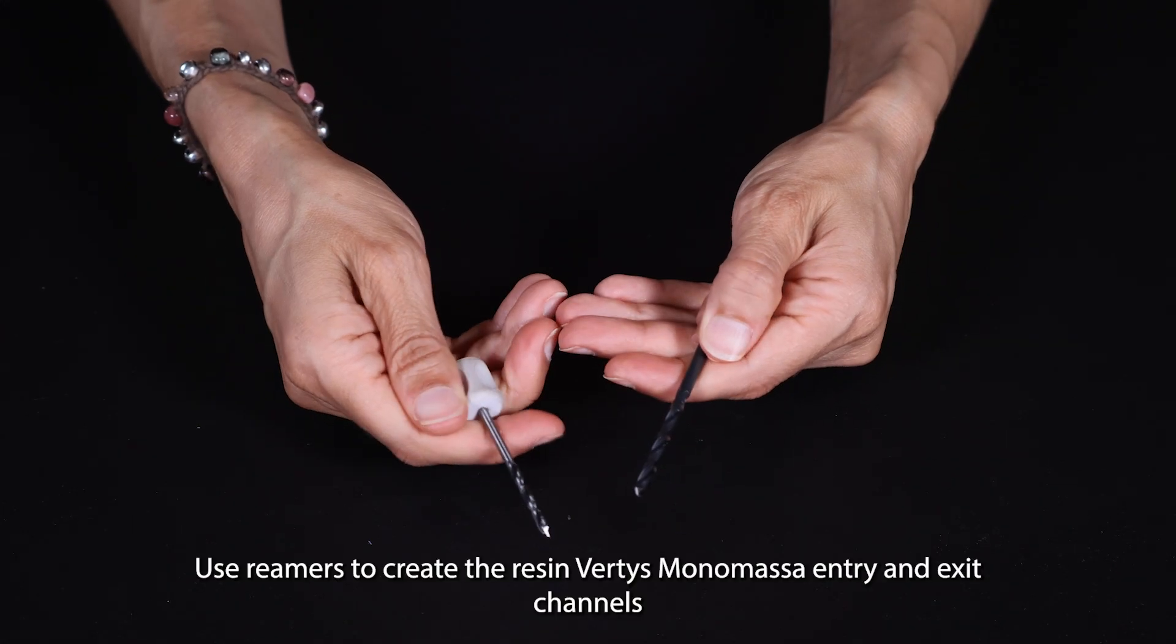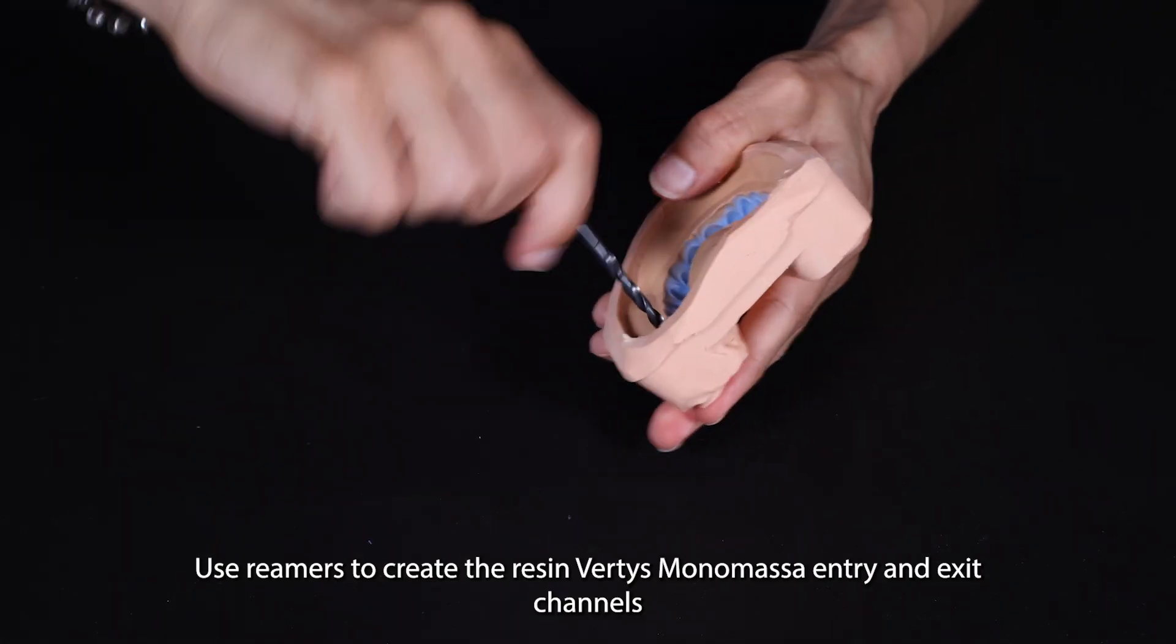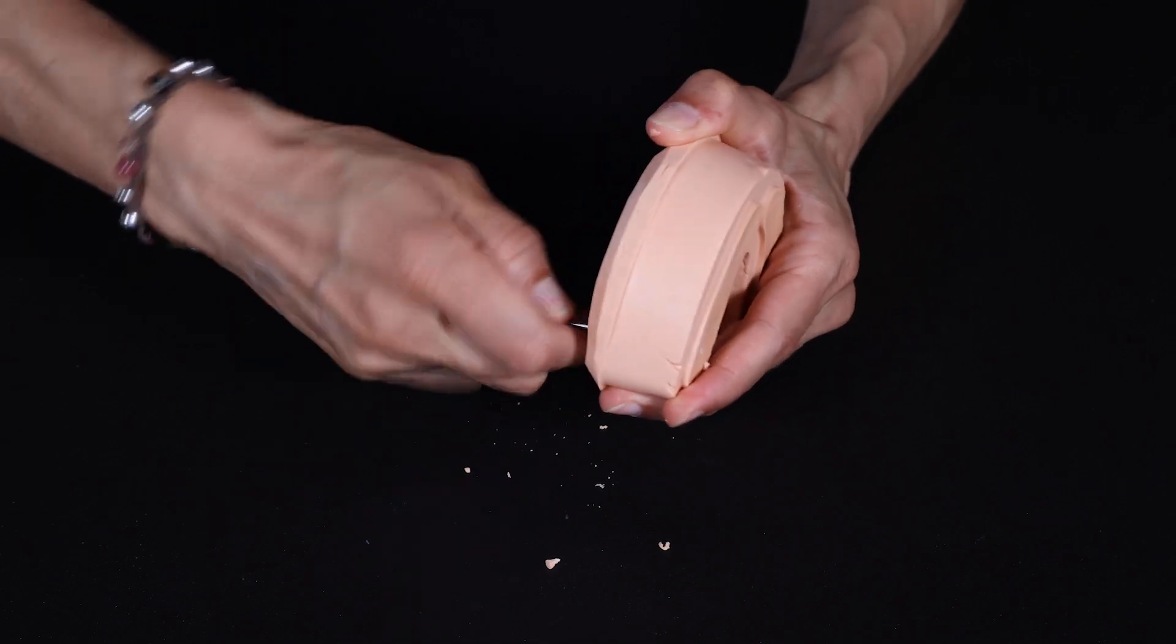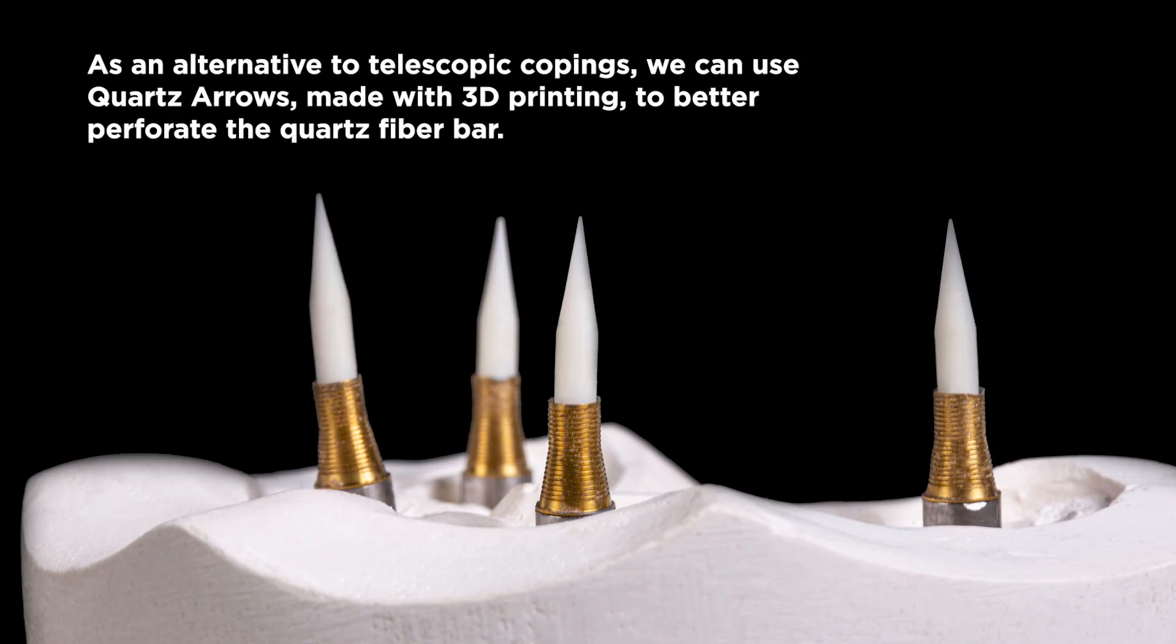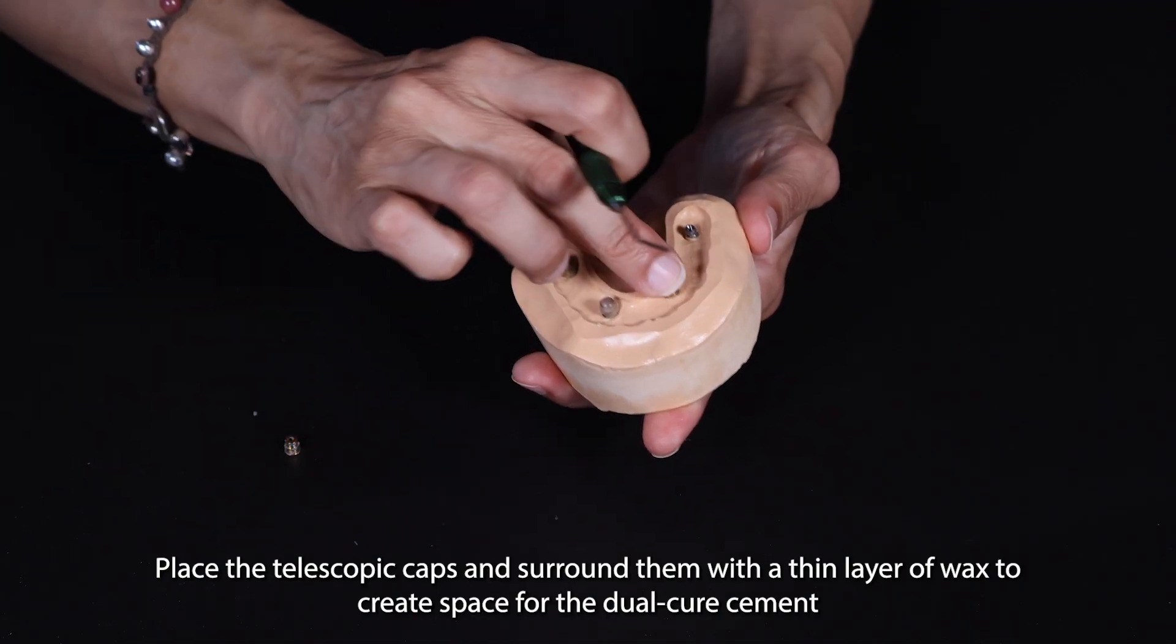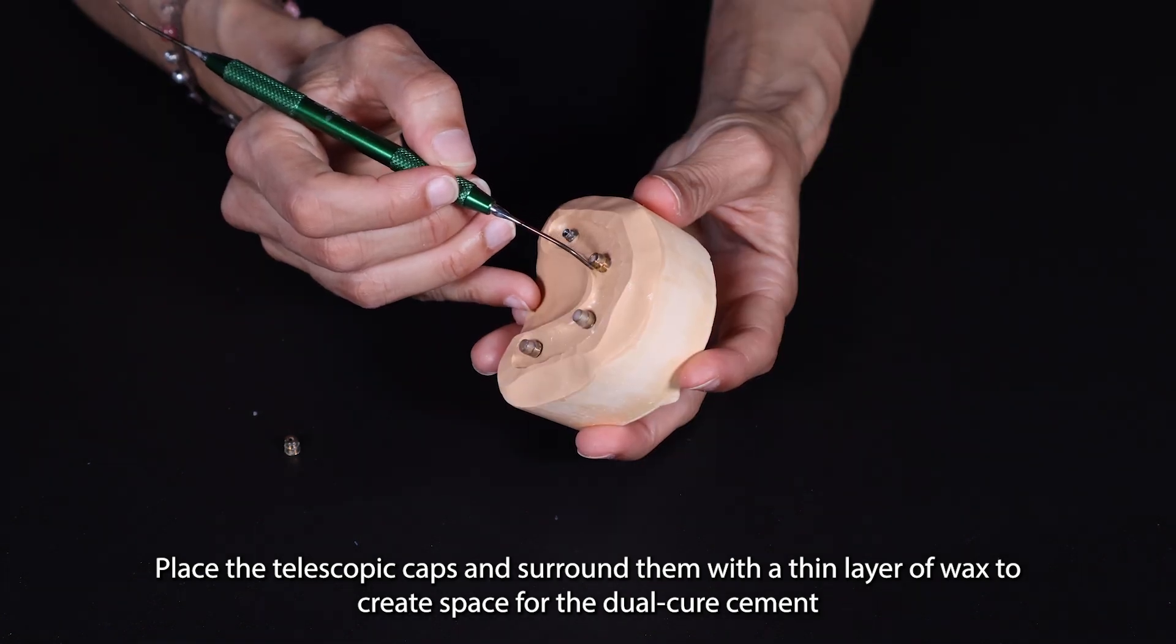Use reamers to create the resin Vertys Monomassa entry and exit channels. Place the telescopic caps and surround them with a thin layer of wax to create space for the dual cure cement.